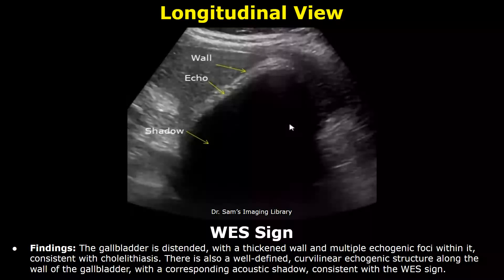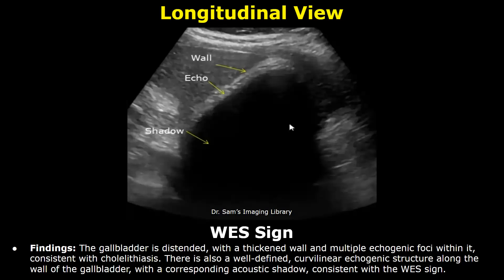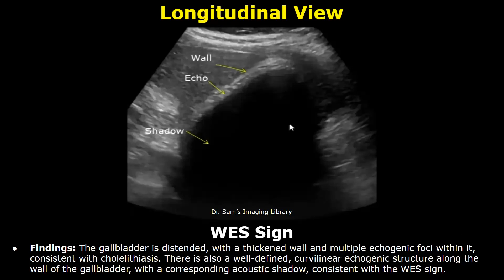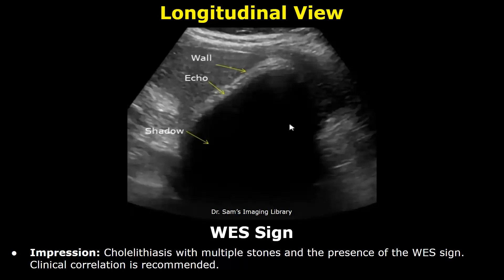Now we will look at the WES sign, which stands for wall echo shadow. It occurs when the gallbladder is completely filled with gallstones. In the findings, you can mention the thickened gallbladder wall and the multiple echogenic foci within the gallbladder, consistent with cholelithiasis. Then you can mention a well-defined curvilinear echogenic structure along the wall of the gallbladder with a corresponding acoustic shadow, consistent with the WES sign. In the impression, you can write cholelithiasis with multiple stones and the presence of the WES sign. Clinical correlation is recommended.